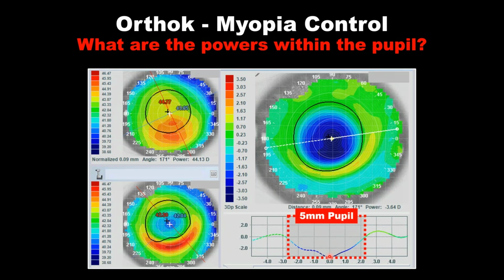That's the center, that's the visual axis. And look for the pattern that follows from center to periphery. If this were LASIK surgery or some kind of refractive surgery, we would hope that we'd have this massive treatment zone. We'd have very little change from the most minus to the edge of the pupil border. We don't want a small treatment area. We want a huge treatment zone.